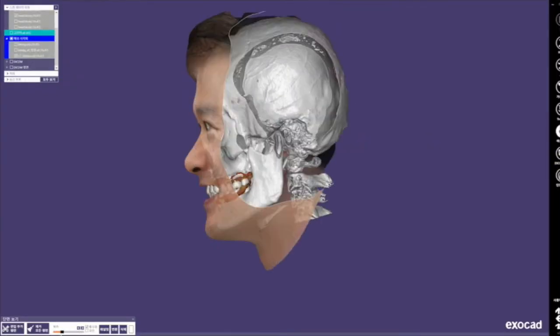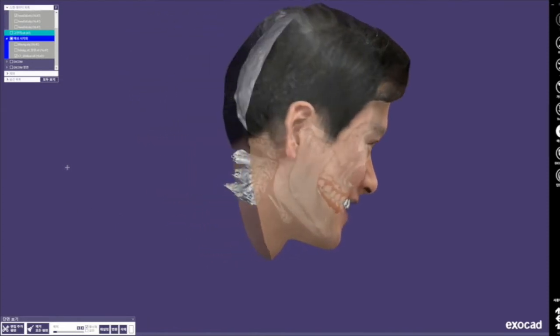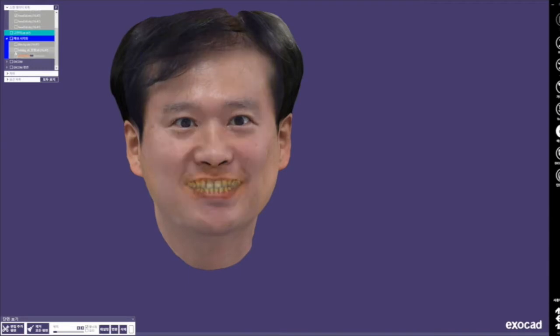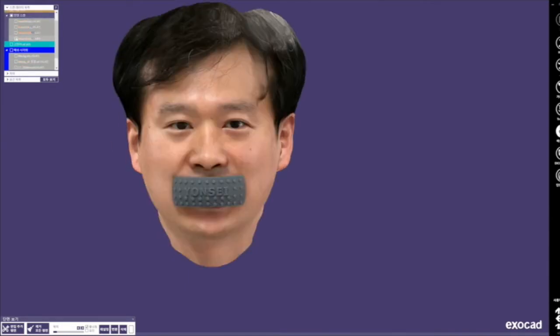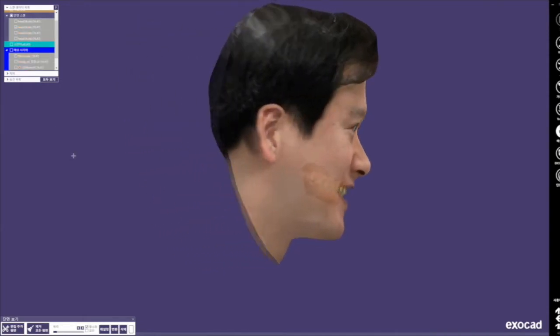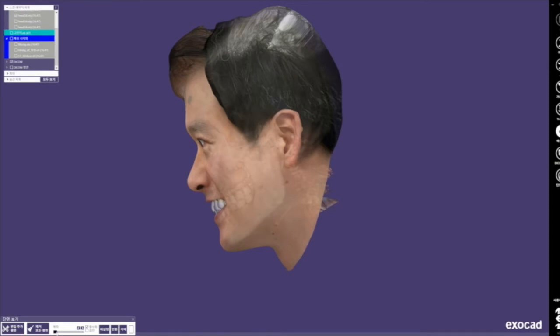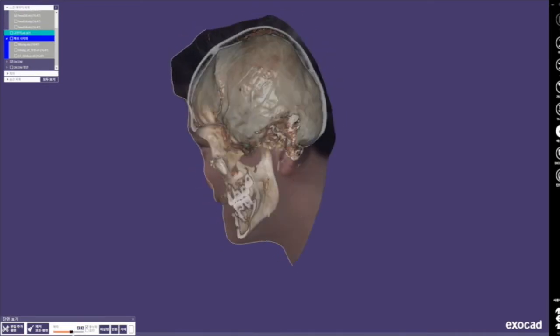Using this device, you can use the facial data for designing the patient's smile. You can appreciate the spatial relationship between the lips and frontal teeth, and you can also check the patient's horizontal and vertical reference lines as well. If you perform those processes, the final outcome can be applied to the patient's real face, which drives the patient's trust to the full for you.